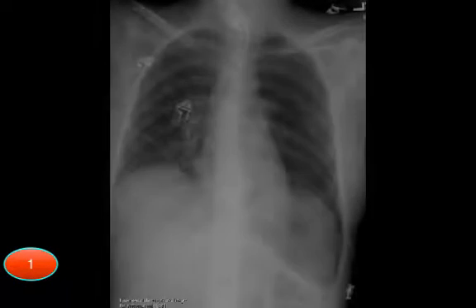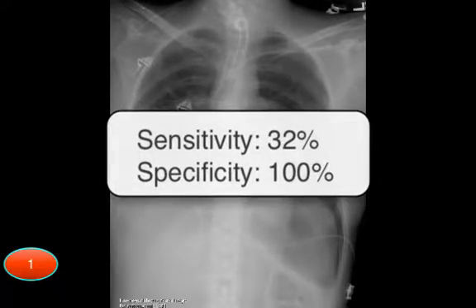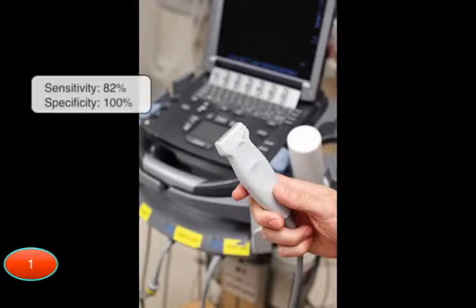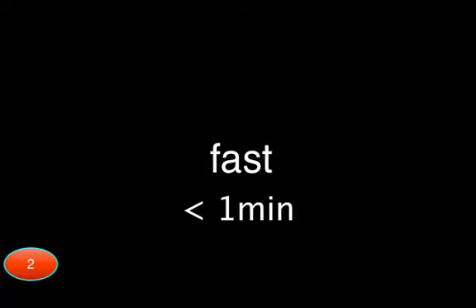First, the supine chest x-ray, our current standard, has terrible sensitivity. Ultrasound? Not terrible. Second, this scan is quick. It should take less than a minute. And third, it's easy to do. I think I can teach you in about 5 minutes.